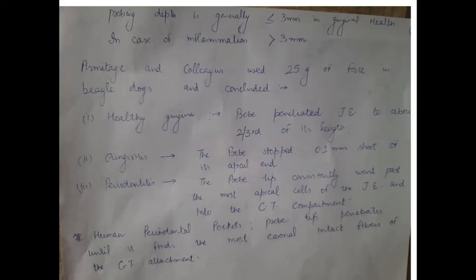Armitage and colleagues, in their landmark study, conducted experiments in beagle dogs with 25 grams of force, and they concluded that in case of healthy gingiva, the probe penetrated junctional epithelium to about two-thirds of its length. Means when the gingiva is healthy, with no clinical signs of inflammation, the probe went up to two-thirds of the length of the junctional epithelium.